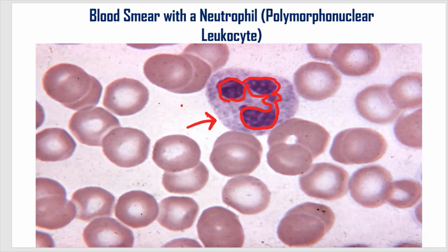Why? Because the nucleus has got multiple lobes. The nucleus is multi-lobed, which has 4 to 5 lobes. Okay. So draw this neutrophil at high power, label it, show the multi-lobed nucleus, and label it as a cell. All right, let's move on.